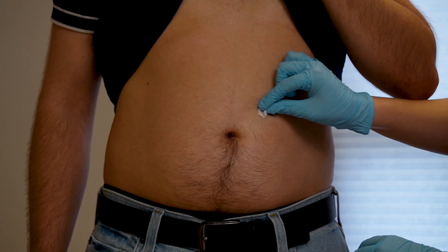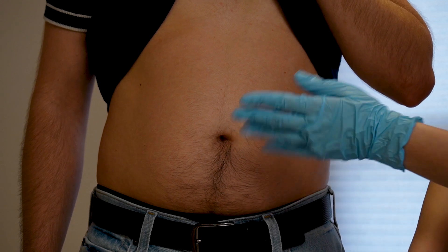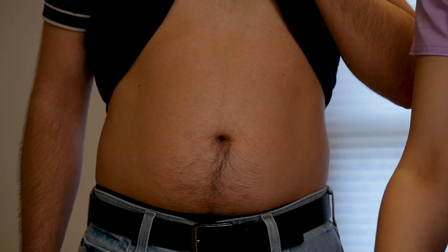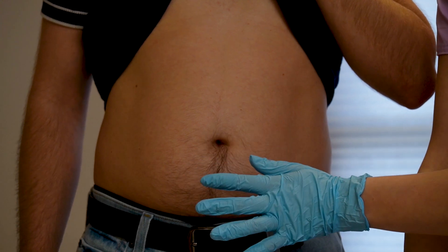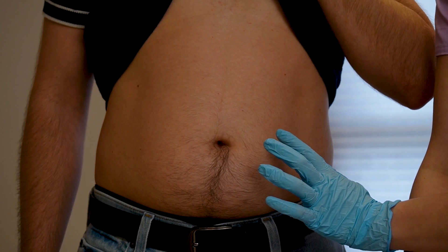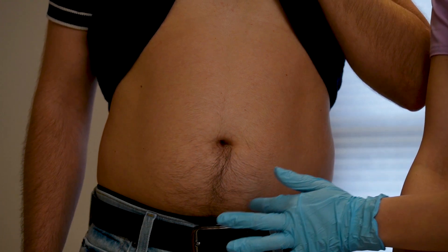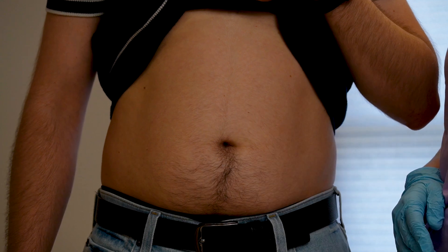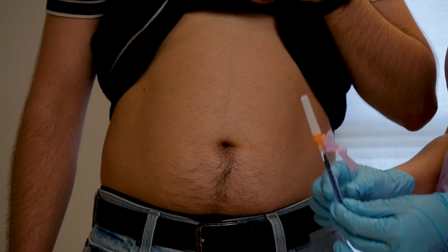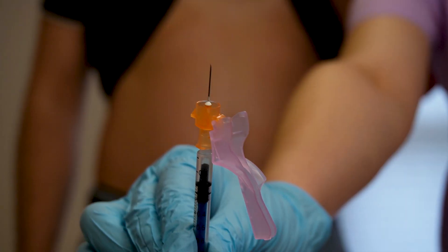Clean it very nicely and just let it dry a little bit — make sure that it's dry. Remember to rotate sites: this time we're doing the left part of the belly, next time do the right side, then alternate to different areas. Now we're ready to move forward — remove the cap. As you can see, the needle is very small and neat.